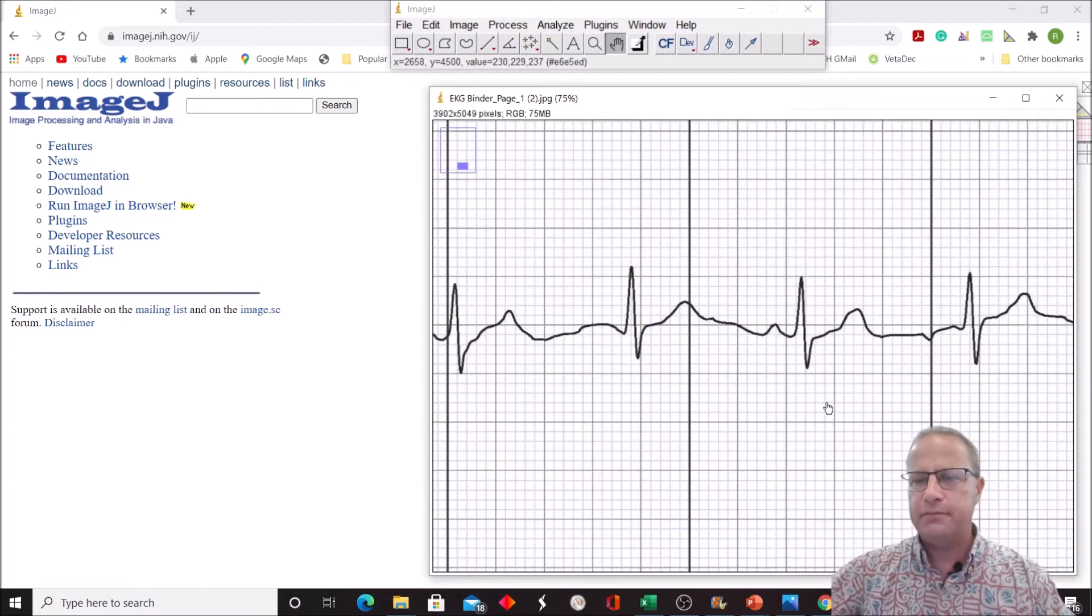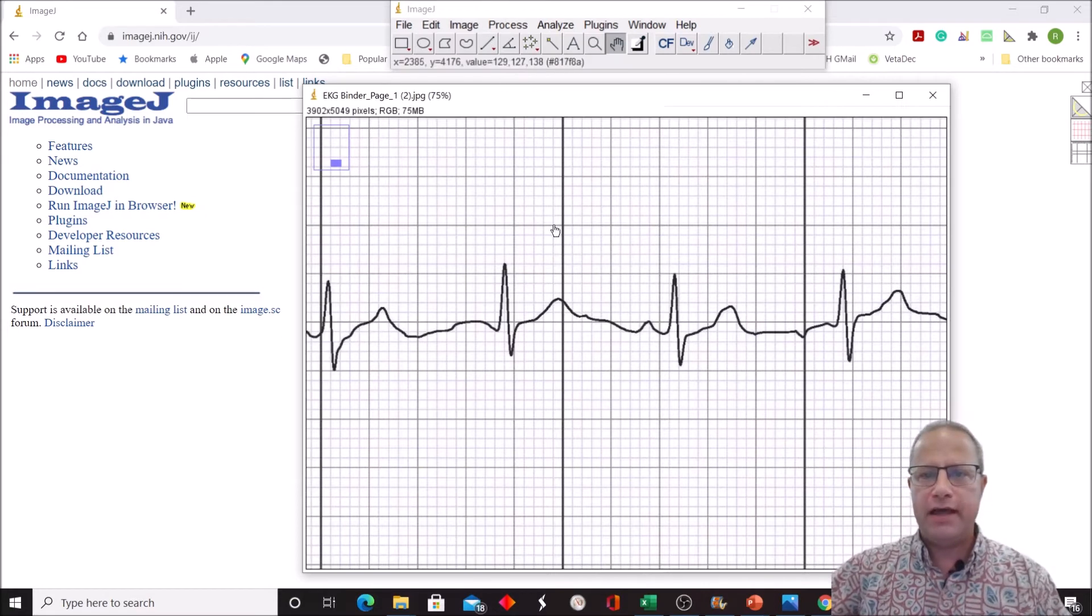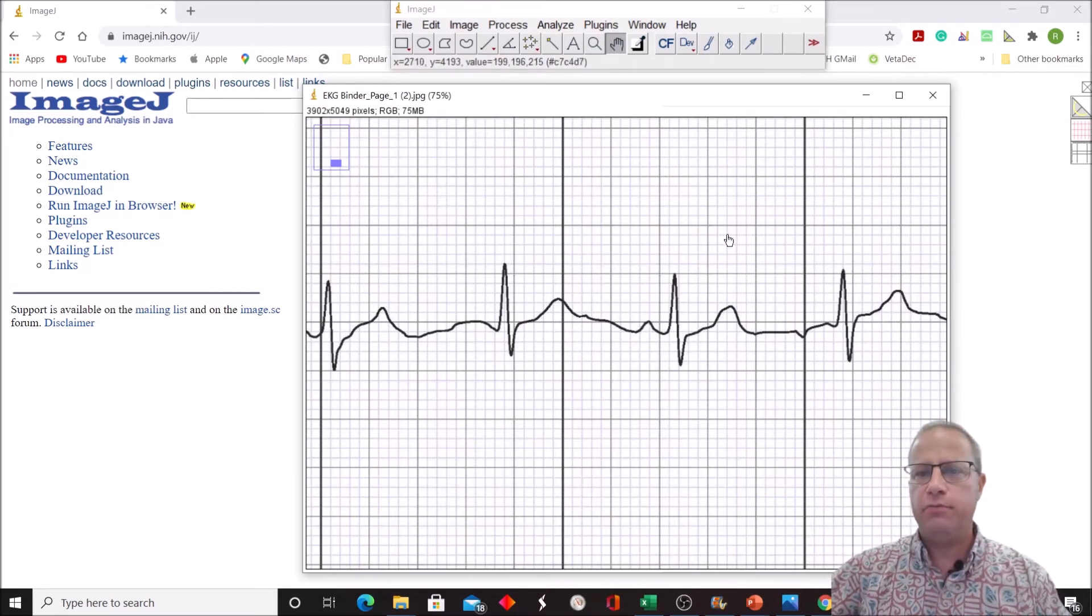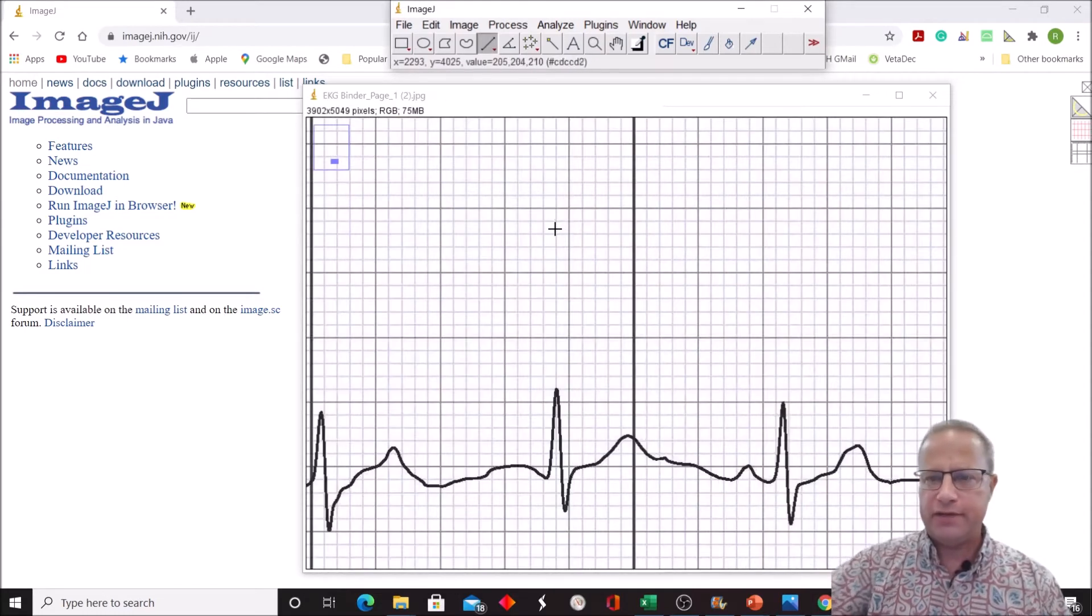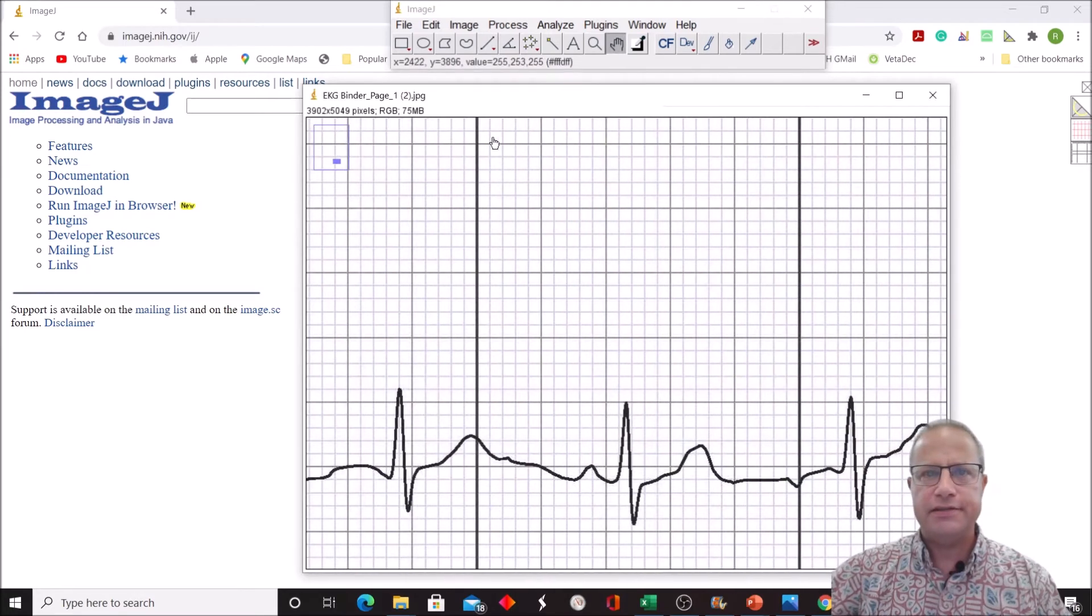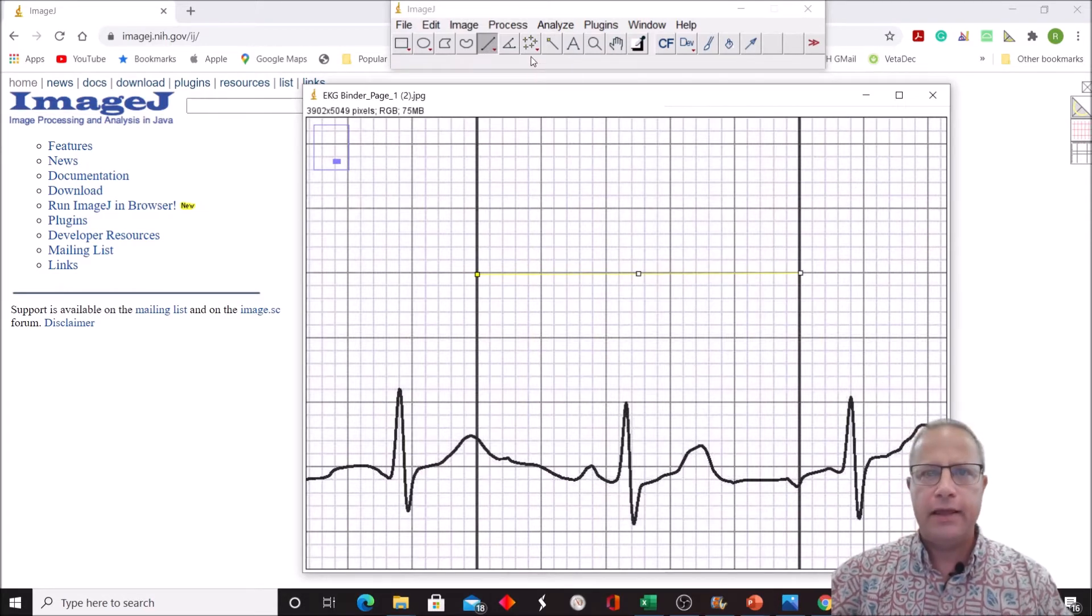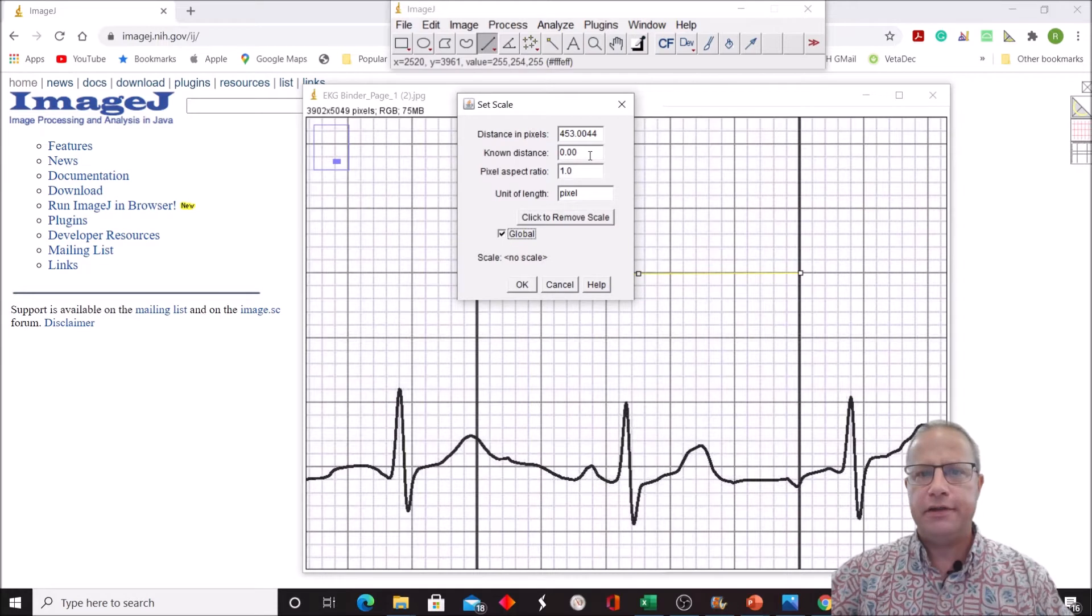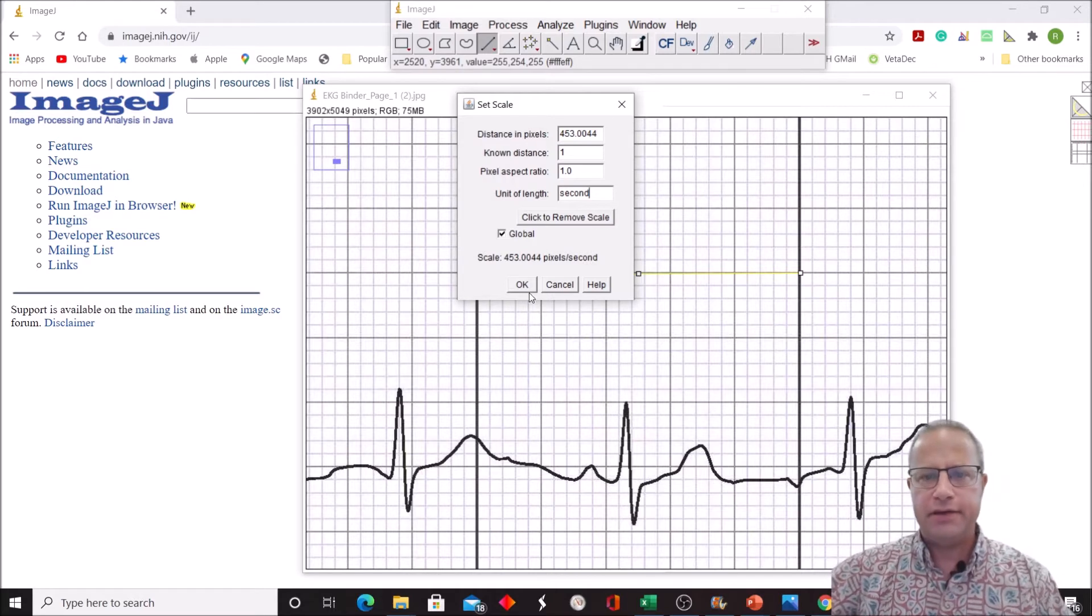Before I start to measure things, I need to calibrate my software. To do that, I want to draw a line between these two big lines. The two big lines are five big boxes apart. Each big box is worth 0.2 seconds, so five times 0.2 is one second. I'm going to zoom in one more time and line up the two lines and draw a line between them. We're going to go Analyze, Set Scale, and tell it Global. We're going to tell it the known distance is 1, and the unit is 1 second, and say OK.